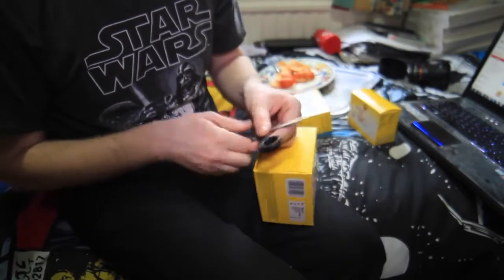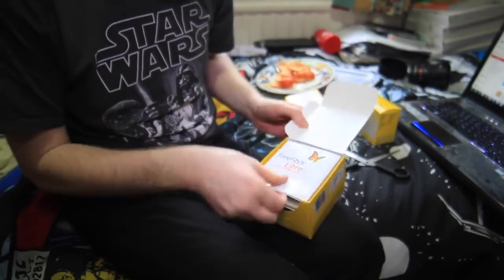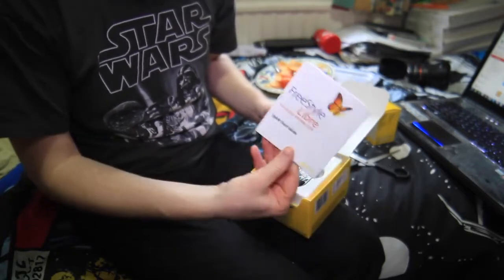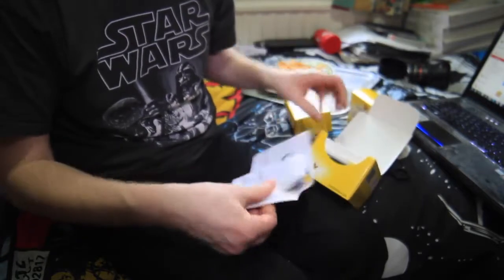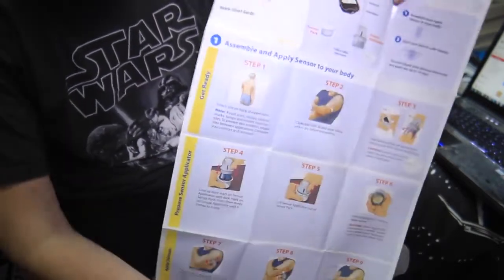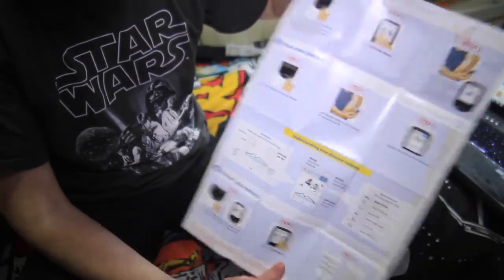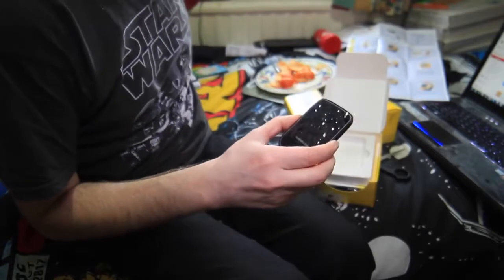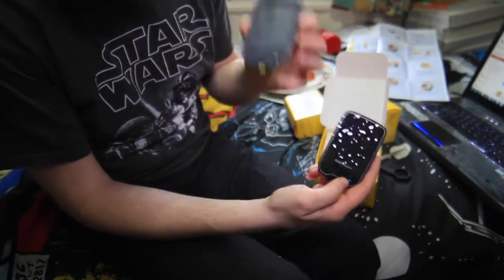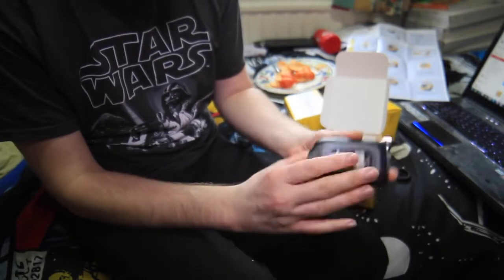I need some scissors to open the box. Straight away I have a quick start guide — that'll be quite useful. It folds out and talks about the monitor, how to use it, and how to put the sensor on. And inside the box we have the Freestyle Libre itself, which is quite similar in size to my normal glucose monitor.